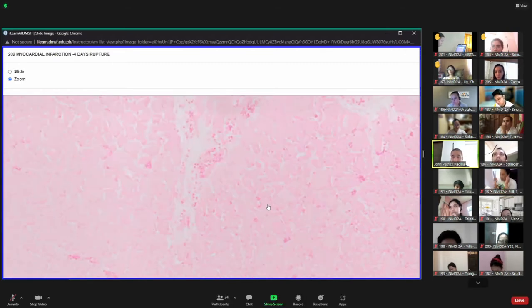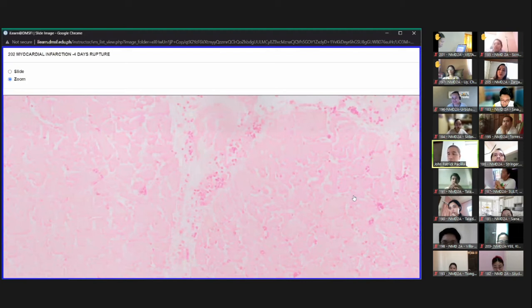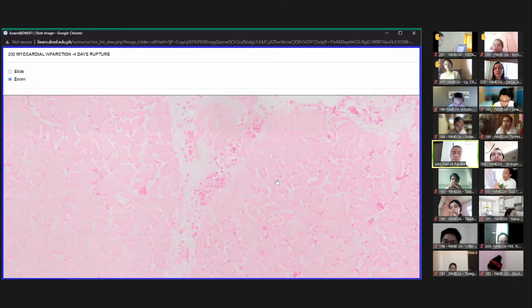Ano siya? Arvin? Sa first 3 days po, Doc, neutrophils. Okay, neutrophil.